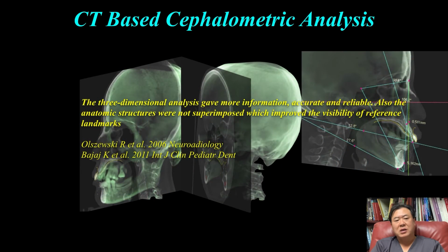Then we want to utilize large FOV CBCT data to perform 3D ceph analysis. People usually get intimidated by ceph analysis because we don't use this method very often in our private practice other than orthodontists. But for the purpose of prosthodontics, it is very simple and easy to use, and it is an extremely useful tool as well. And all of you can learn this cephalometric analysis in less than 5 minutes, I believe.